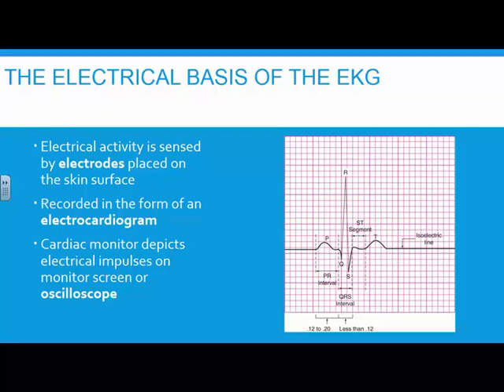The electrical basis of the EKG. So, I had this big long spiel about the history of the EKG, and I'll give you a little bit of it. The history of the EKG started with some frogs.